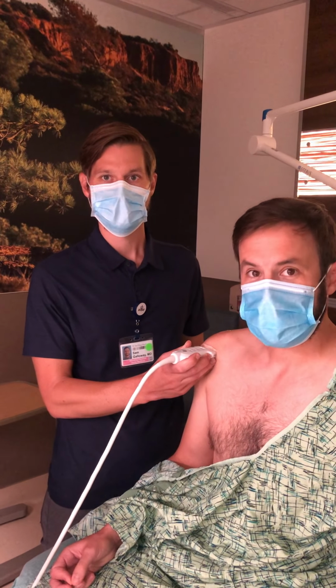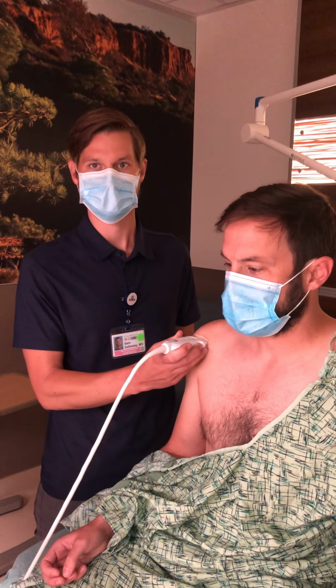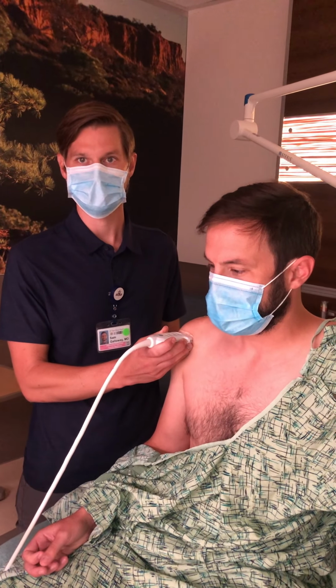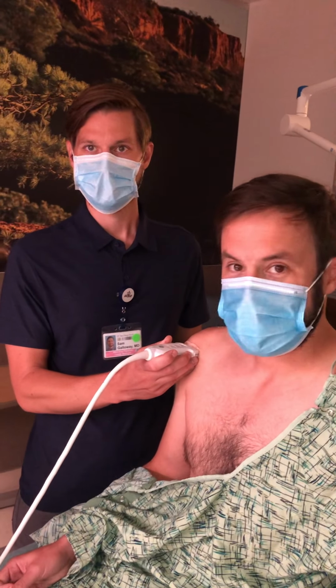So we get patients all the time in the emergency department and they have shoulder pain and we just get an x-ray and it looks okay and we send them out and send them to you. But you might be able to teach us a little bit about how we can give them a more firm diagnosis. So how do you start with the shoulder ultrasound?